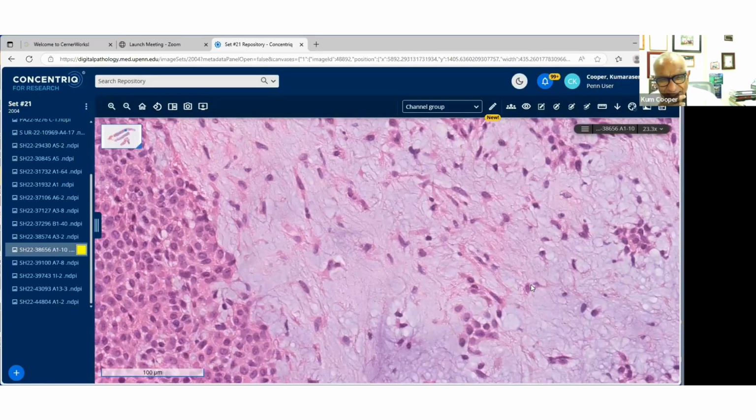This doesn't have that. Also, unless you're thinking about a round cell sarcoma, which is a high-grade myxoid liposarcoma, for the cellularity to go along with that would be a thought. But the absence of the chicken wire vascularity makes me move away from myxoid liposarcoma.